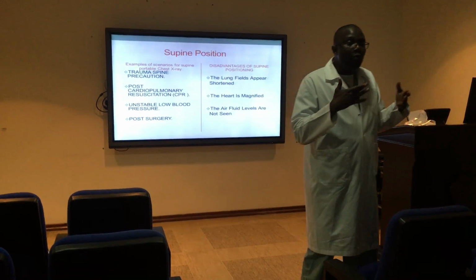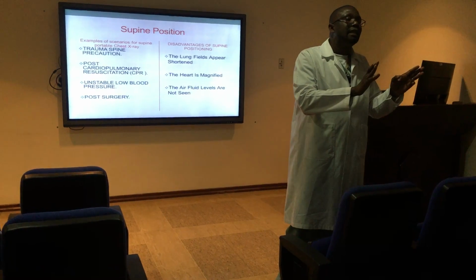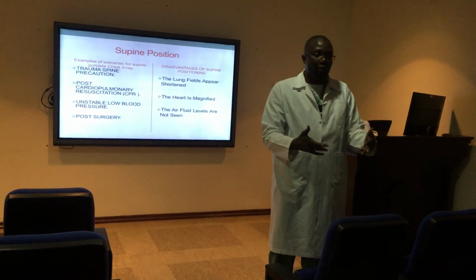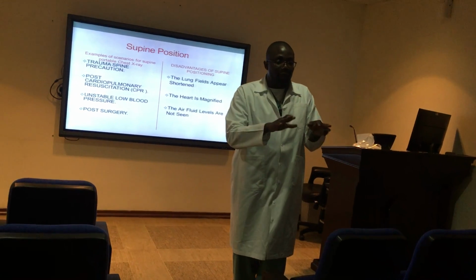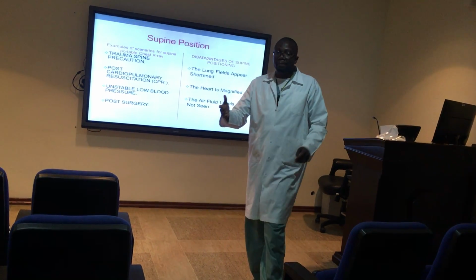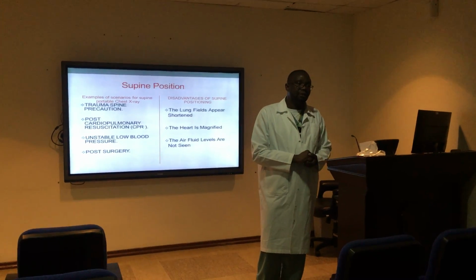If the doctor now wants it to be done semi-erect or AP sitting, then they must have cleared some other stuff. At least you are getting this from the doctor or the primary nurse. You are not going to determine that the exam must be done AP sitting here, okay? Or a patient who just had a spine surgery and they need to do the chest X-ray.